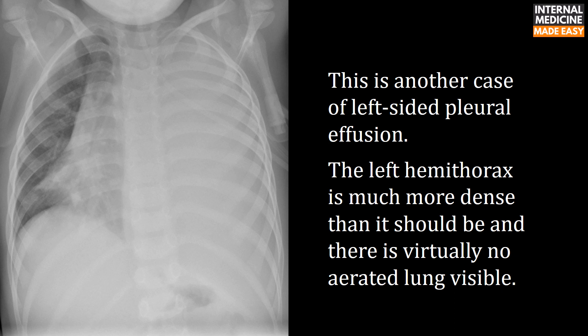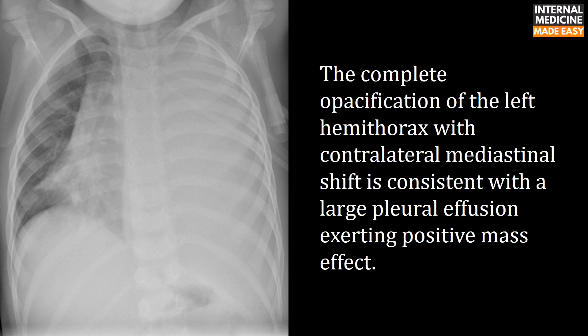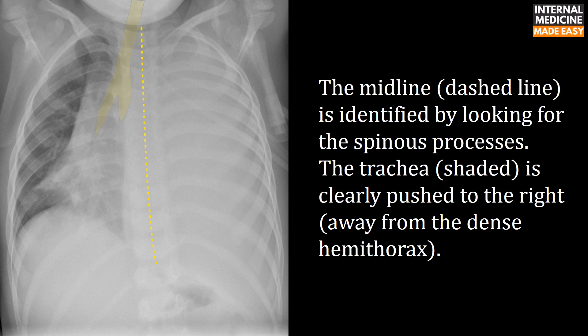This is another case of left-sided pleural effusion. The left hemithorax is much more dense than it should be, and there is virtually no aerated lung visible. The complete opacification of the left hemithorax with contralateral mediastinal shift is consistent with a large pleural effusion exerting positive mass effect. The midline is identified by looking for spinous processes; the trachea is clearly pushed to the right, away from the dense hemithorax.